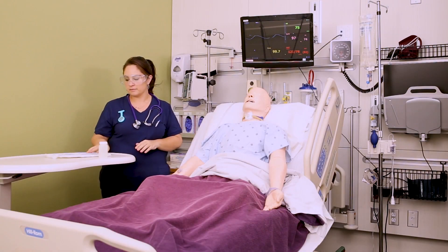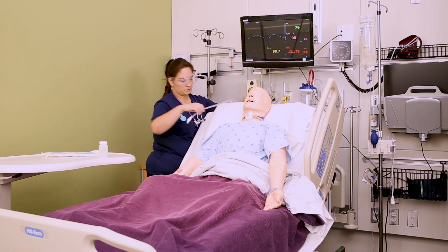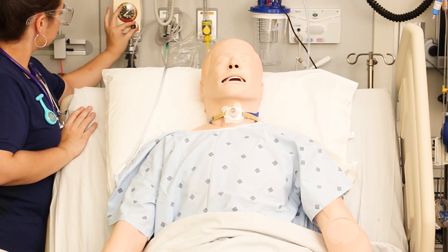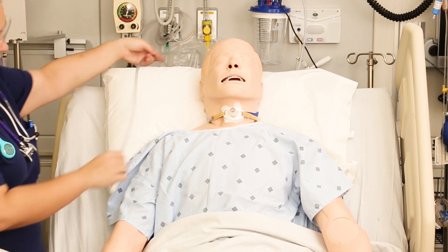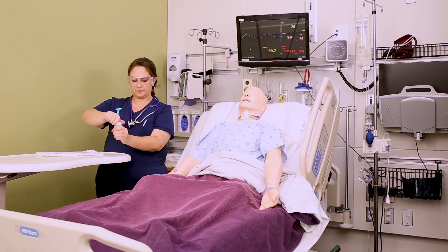First thing you want to do is make sure your suction setup is working. You should have tubing attached to a canister attached to a regulator. For this you want to set it on continuous medium suction. Also make sure that you can reach the end of the tubing — sometimes I just lay it over the head of the bed or on the patient's chest. You can also loosen any oxygen device that they have at this point.